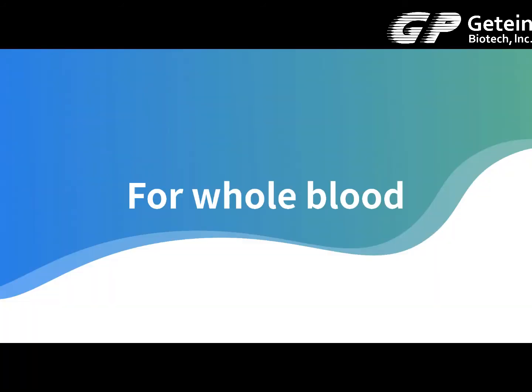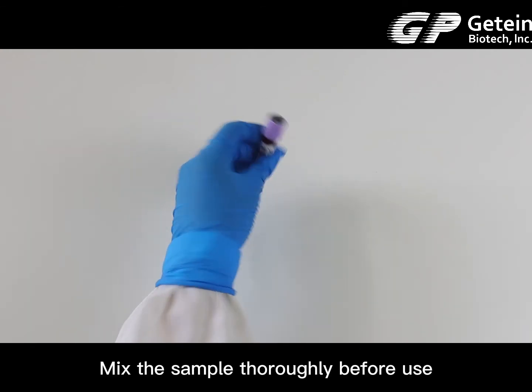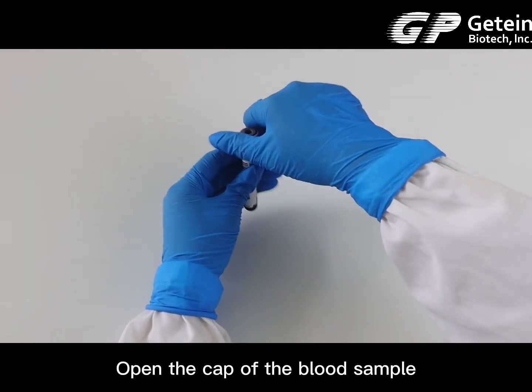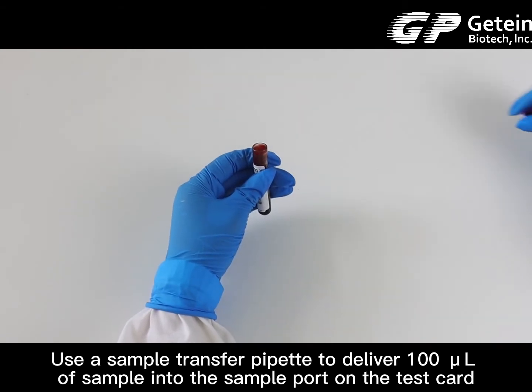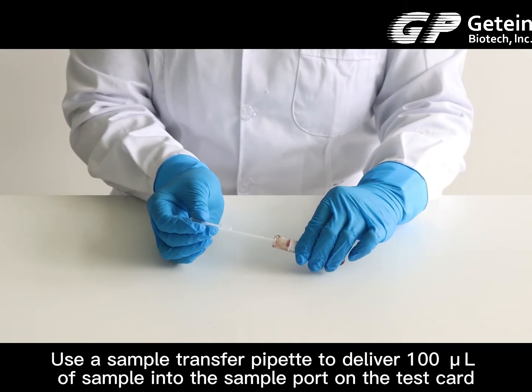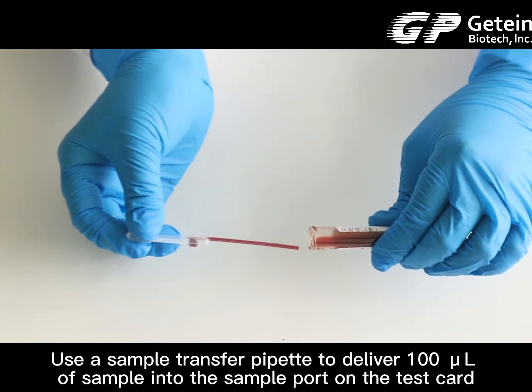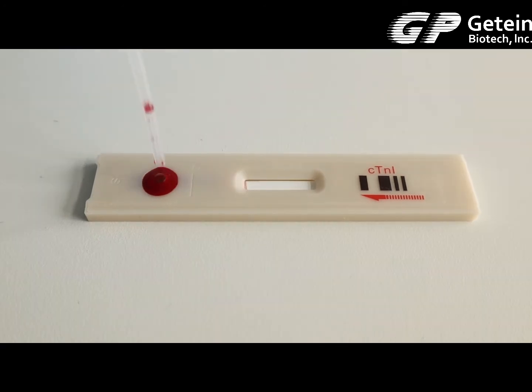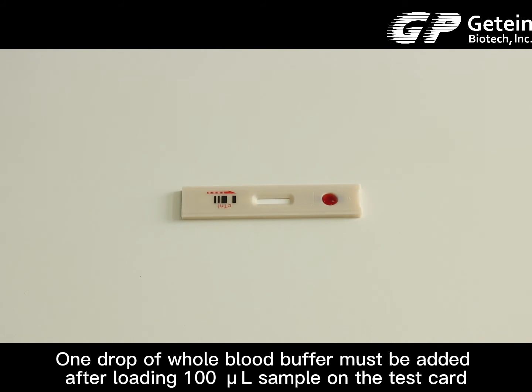For a whole blood sample, mix the sample thoroughly before use. Use the sample transfer pipette to deliver 100 microliters of the sample into the sample port on the test card. One drop of whole blood buffer must be added after loading the 100 microliter sample on the test card.